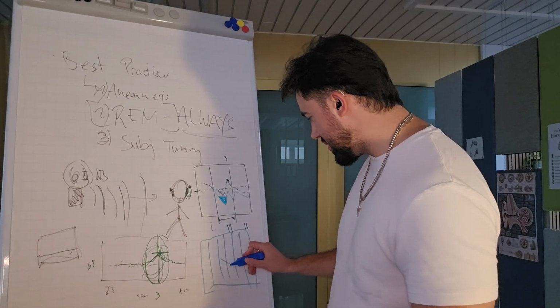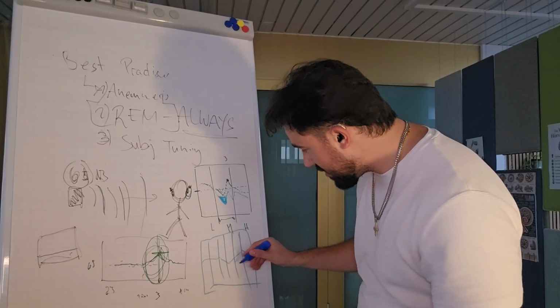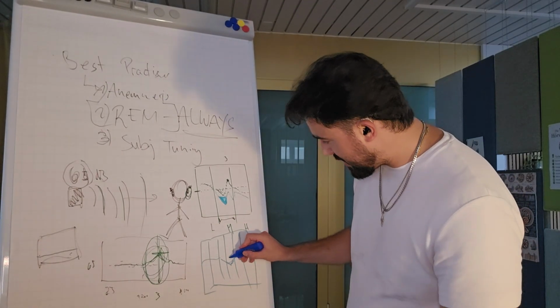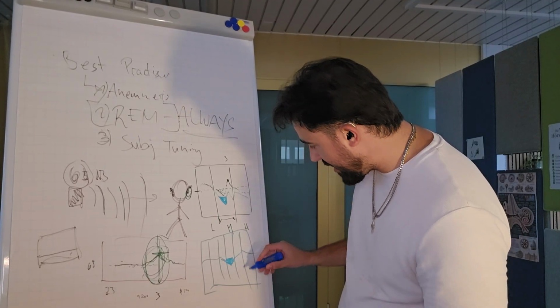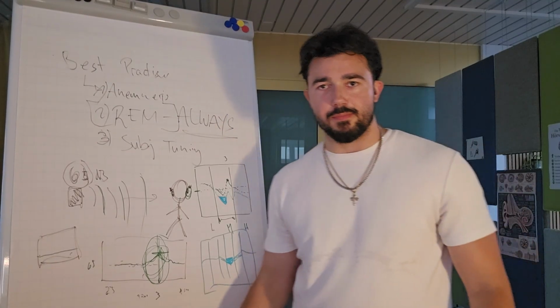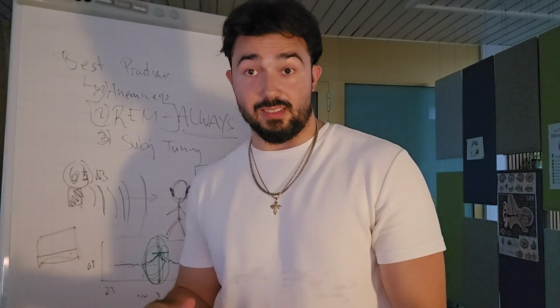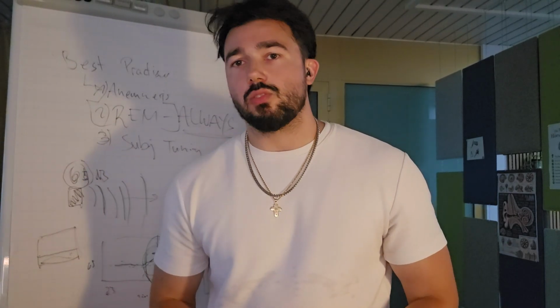So if you have something like this, then you can at least see this is too little. The hearing aid acoustician can measure everything. They see, okay, something's lacking here, let's amplify this. So you end up over here. This is actually fine, okay? This is too much here, maybe. You reduce this, right? Point is, you have much more control over the frequencies that decide how well you understand speech and how good everything sounds.